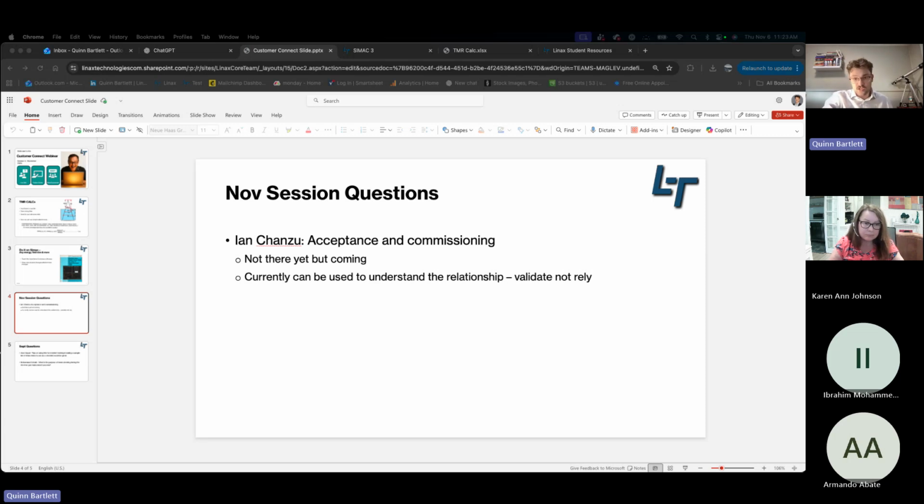Can we use TRS 398? Yes, great question. You can absolutely use TRS 398. We call it TG51 just because we're in North America and that's what we call it. But I've been working with people all over the world with this, and I have yet to find where the difference of TG51 and TRS 398 come in.